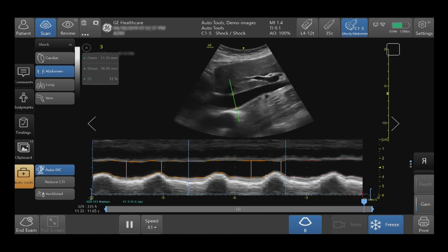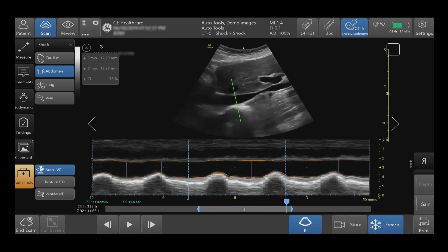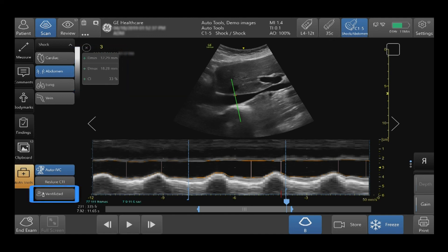When yellow, results should be taken with caution. When red, the results are not shown on the system. Auto IVC will automatically calculate the maximal and minimal respiratory cycle. Your IVC collapsibility will be displayed. For ventilated patients, tap on ventilated to acquire your distensibility index.